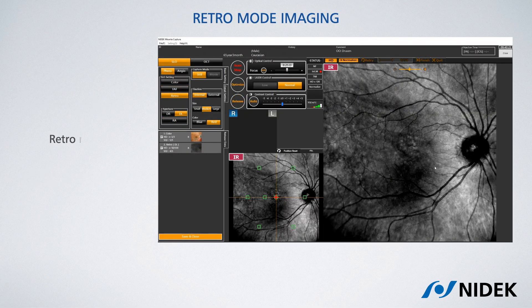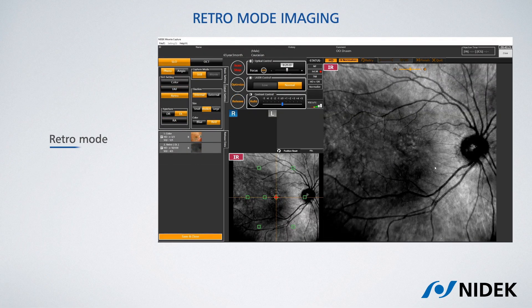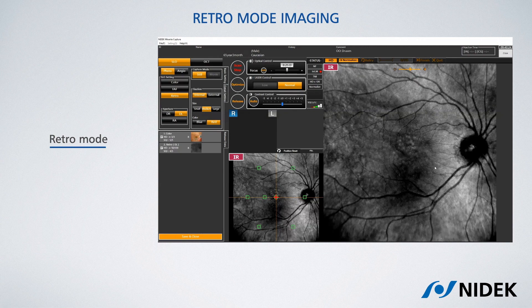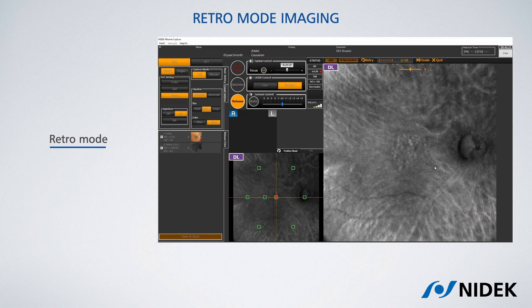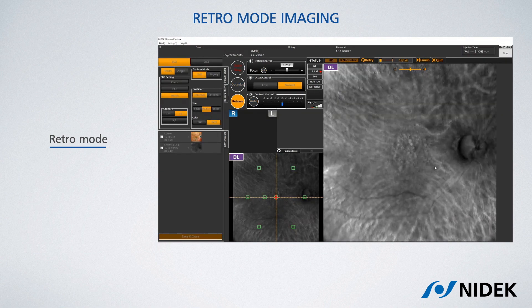In this very same way you can also capture retro mode images. Retro mode is a unique technology that captures the backscatter component of infrared light to create this innovative effect of retro illumination of the retina.